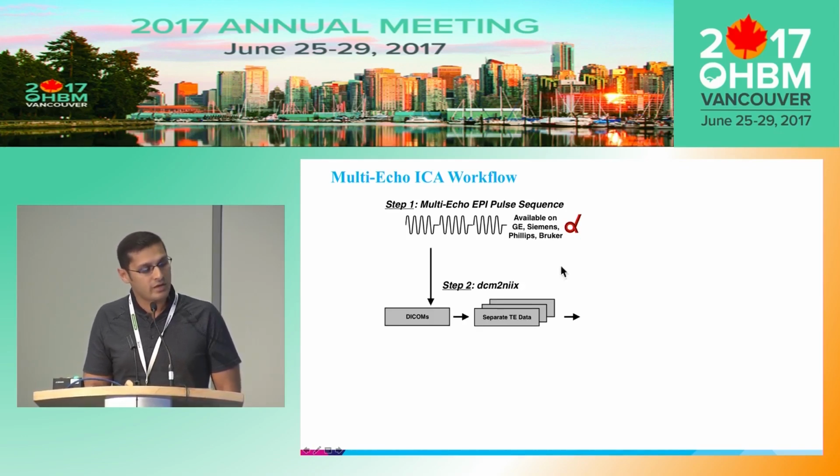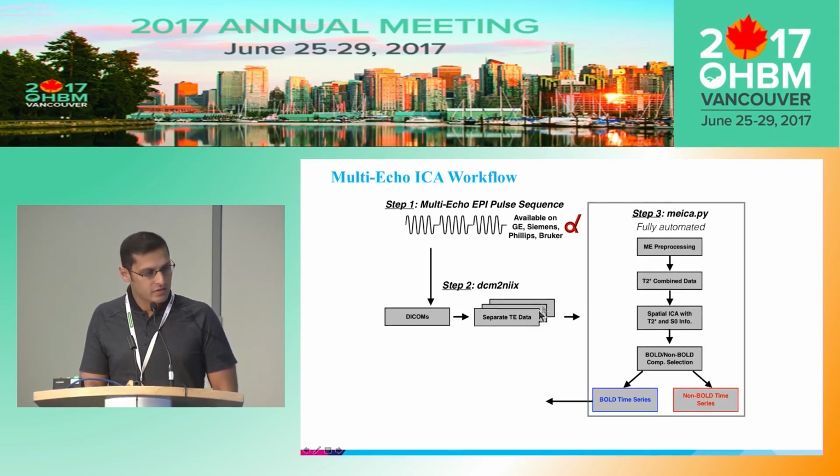Then you basically take the DICOMs that come out of your multi-echo scan and feed them to dcm2niix, which you might be familiar with from MRIcron. It spits out separate TE data time series. This goes into our fully automated tool distributed with AFNI called meica.py, and it handles pretty much everything.